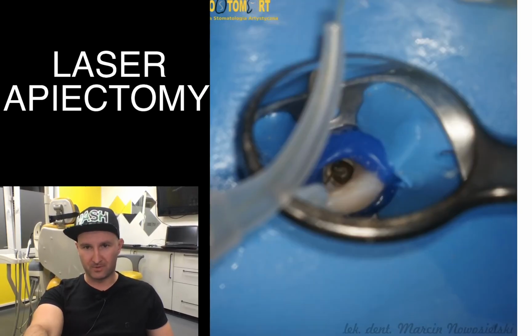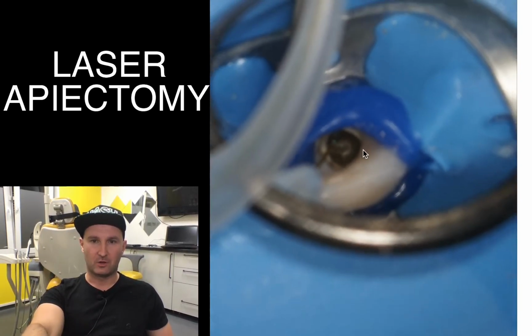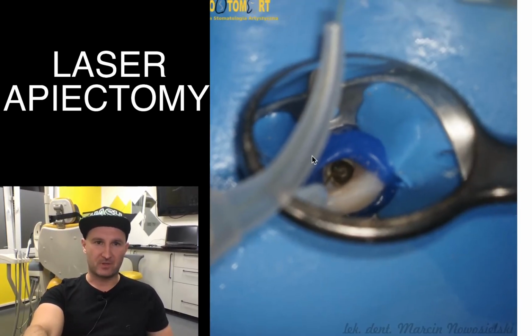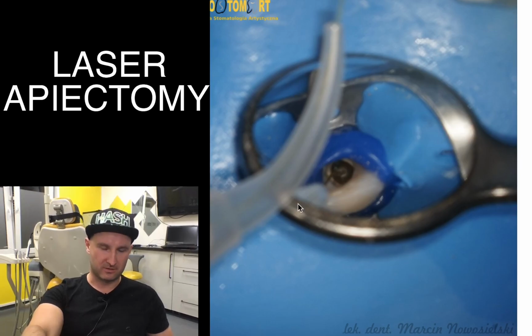This is why in the case of retreatments, I always prefer to disinfect the inside of the teeth with the other laser, with neodymium laser, Nd:YAG, with wavelength of 1064 nanometers. I will present you on the video how it works.